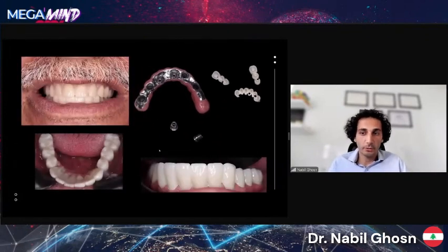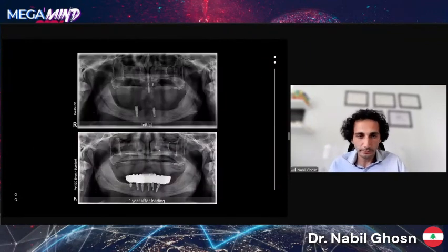The Ti-bases were cemented to the metal bar, and the zirconia crown cemented from the other side, while still having through access if we'd like to remove and place back the bridge later on.